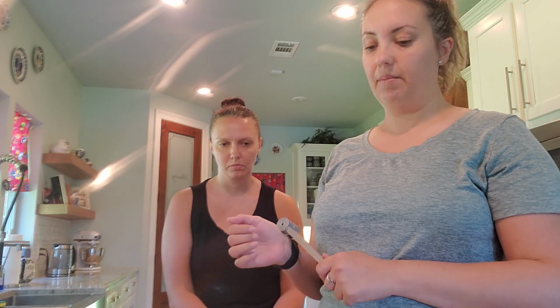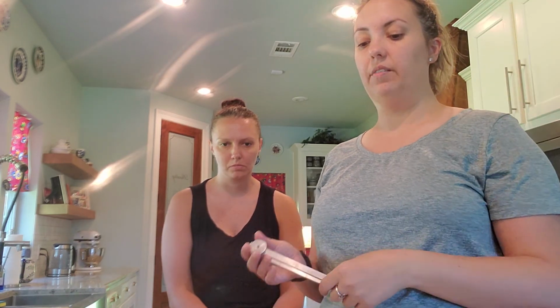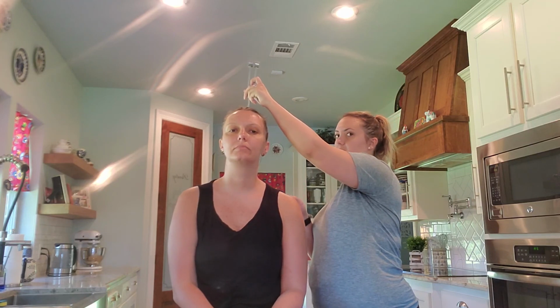Now we're going to do cranial nerve 8. We're going to do the Weber, Rinne, and whisper test. First we're going to do the Weber test. So I'm going to strike my tuning fork with the back of my hand, and I'm going to place it in the center of my patient's head and ask if she hears better in one ear, both ears, or the same in both ears. Okay, where do you hear? Bilateral. Okay, so she hears in both ears.